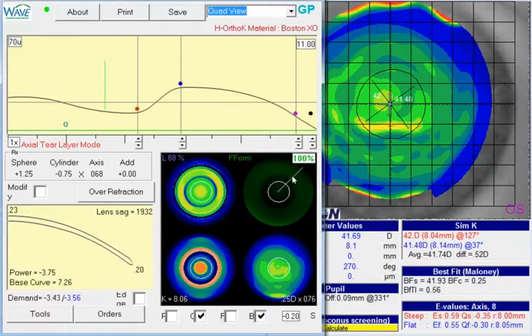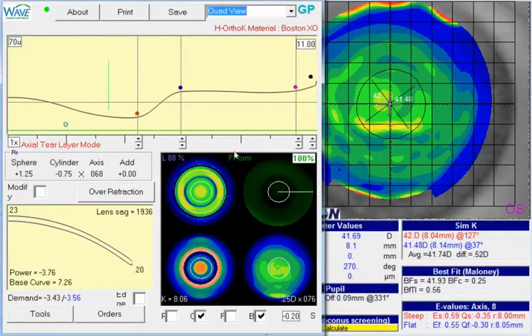We're still pretty uniform going around. So I would start with this on the next design of lenses so that gets the patient a little bit more steepening centrally and better correction of the hyperopia that's there.